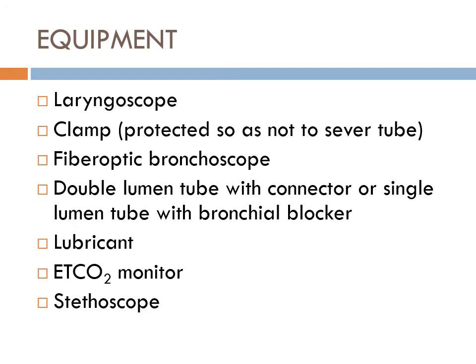I would test these balloons like you test your endotracheal tubes ahead of time, just to make sure they inflate and hold. When you test it with air, you have to take the syringe off, because not only do you want to make sure that there's no air leak here or in the line or in the cuff, but you also want to make sure this little pilot thing doesn't leak. If you leave the syringe on, you won't know that, because the pilot will close afterwards. But it should correlate.